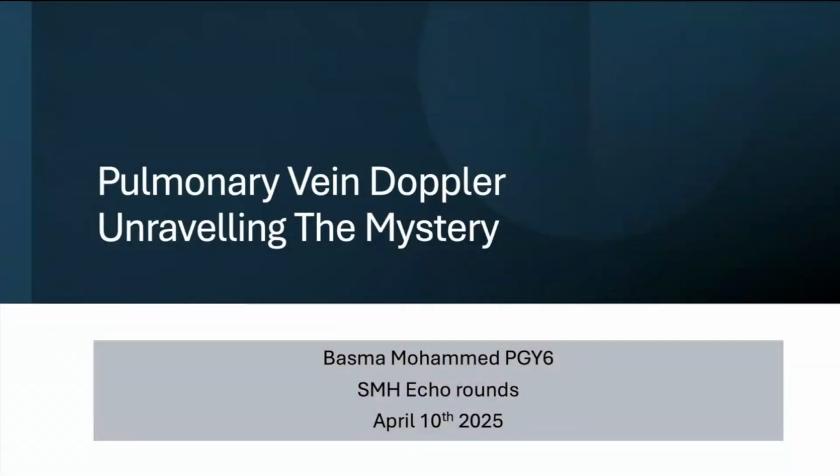My name is Basma. I'm one of the cardiology residents. I'm doing echo right now, and I'm going to present the pulmonary vein Doppler. I called it unraveling the mystery because this is how I felt about it until today, and hopefully by the end of it, you guys will feel the same.